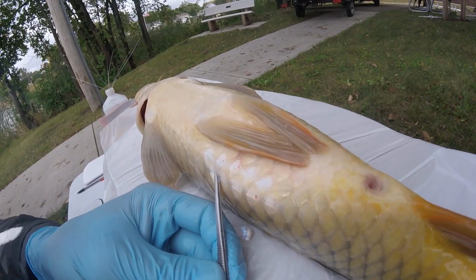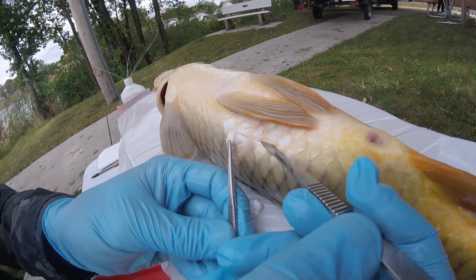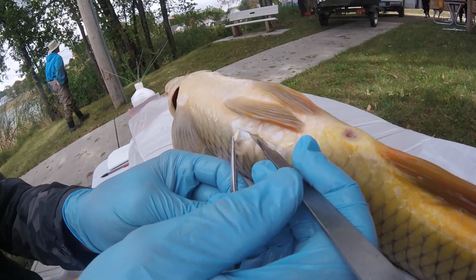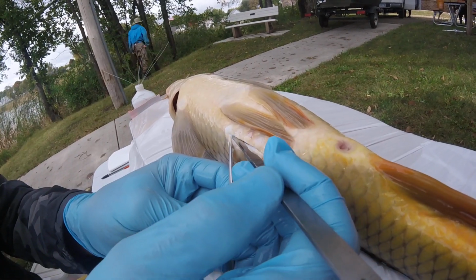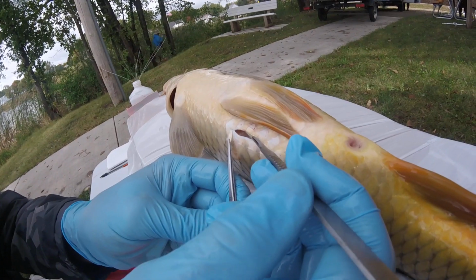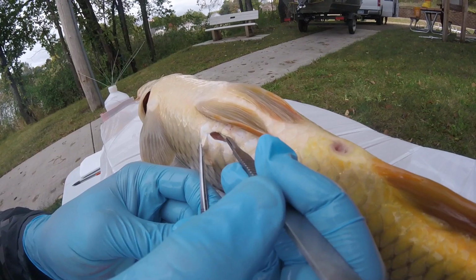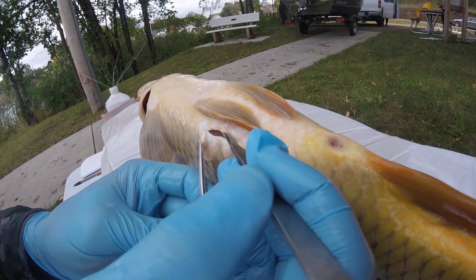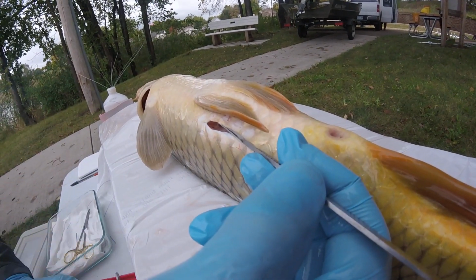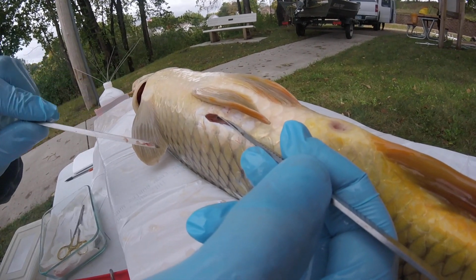Then go in here, and I'm going to go ahead and make an incision. Straight down. Okay. Straight down, and I'm going to go with small cuts, partially by feel, partially by sight, and keep cutting down until I go through the body wall. And you see that hole there? Yep. So now, in this case, there's no blood. There's a little bleeding there, but you can see in there.